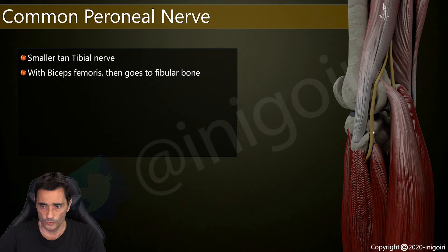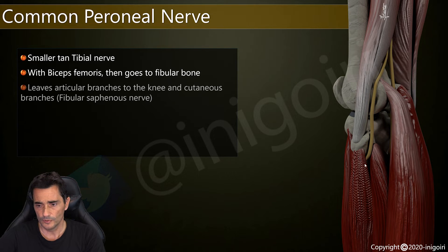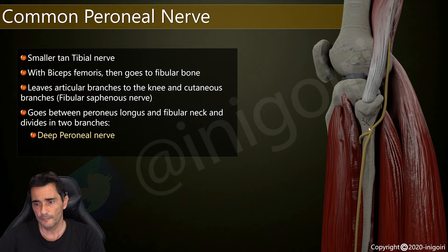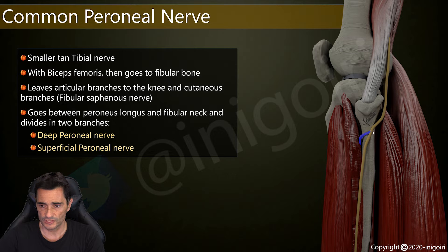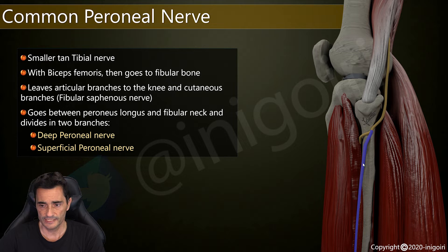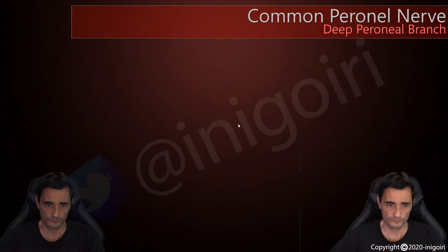Once the nerve reaches this area, it continues below, underneath the peroneus longus muscle, into the peroneal tunnel — which is below the peroneus longus muscle and above the neck of the fibula. At this level it divides into its branches: the deep peroneal nerve, also called the deep fibular nerve, which goes deep toward the interosseous membrane, and the superficial peroneal nerve, which continues underneath the peroneus longus and becomes superficial. We will first follow the deep peroneal branch.